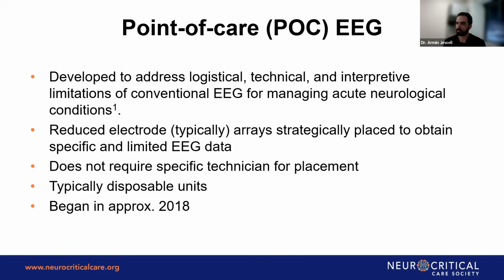The benefit with point of care EEG was also that it doesn't require a technician for placement. So training can be done for anyone: physicians, nurses, techs, anyone really can do these. The goal is to be more universal and have that availability for everyone to place. They're usually disposable units. You place the electrodes on the patient, and we'll show some examples of different ones. And this started in 2018, so it's not even a decade old. Several different models have been developed, and it's rapidly expanding, certainly.